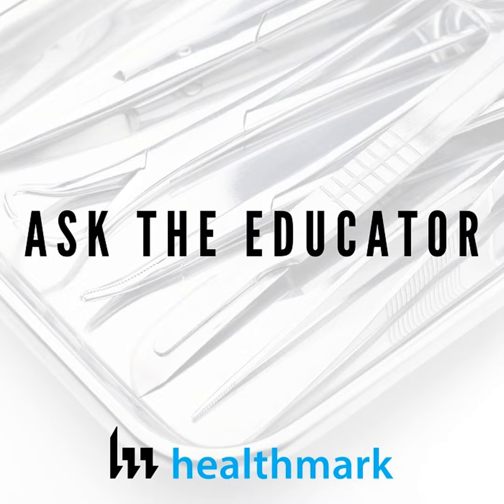You're further complicating this, because the scale itself is relatively simple, but we know there are things that go in the gray lines, right? One of these things was percutaneous procedures. Can you give a little more information about what a percutaneous procedure is and how they can sometimes complicate things? Yeah, so percutaneous is anything that's going through the skin.